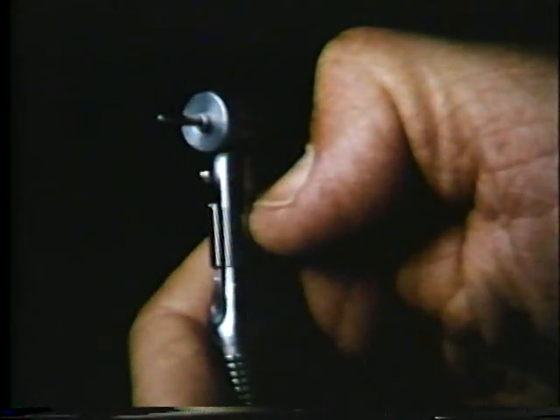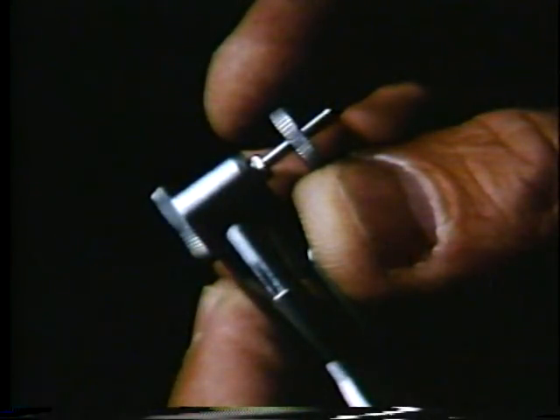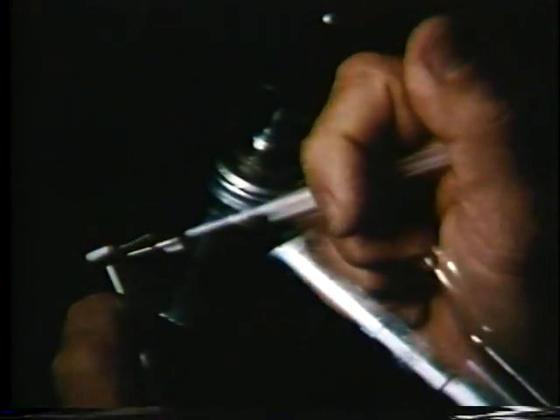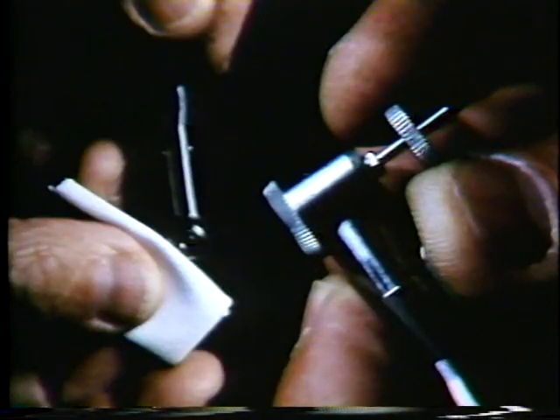While the hose is still attached, slide the spray clip back. Remove the end cap and insert the tip of the grease syringe in the small hole of the turbine. While the handpiece is running, push the end of the syringe until a small ring of grease appears. Stop the handpiece and wipe off the excess grease. Be sure to use a lint-free cloth. Put the end cap back on and repeat the procedure on the other end.